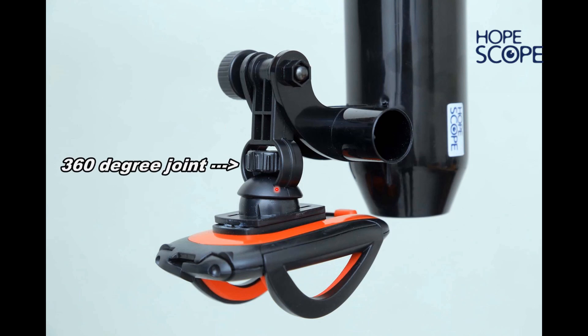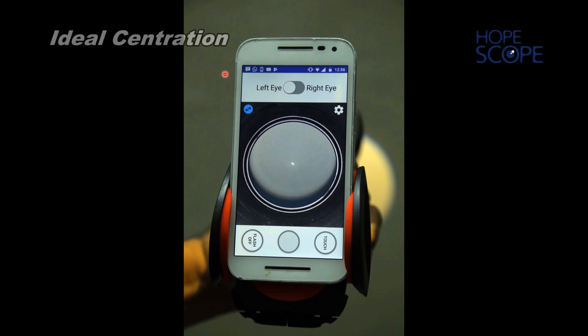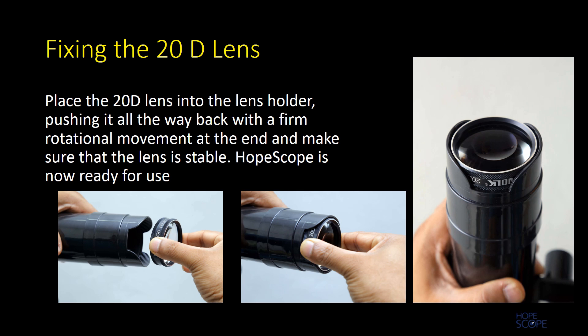The 360 degree joint and the elbow joint are used for vertical alignment. An ideal centration would look like this — a centered image almost occupying the full screen. To place the 20 diopter lens into the lens holder, push it all the way back with a firm rotational movement at the end and make sure the lens is stable. The HopeScope is now ready for use.